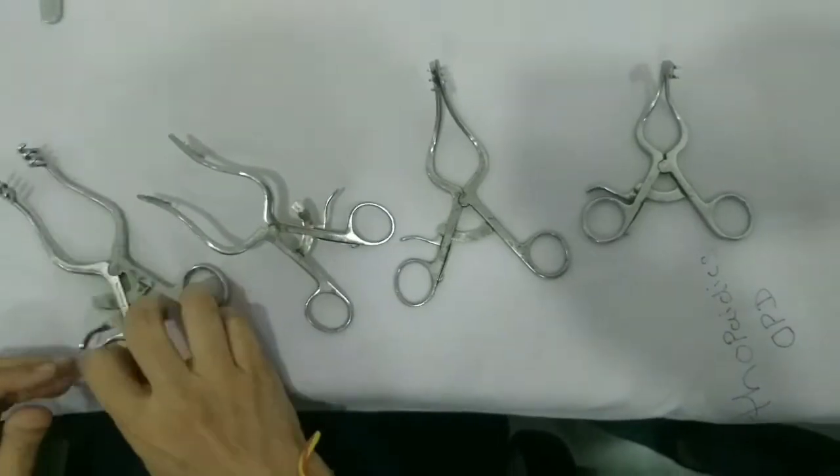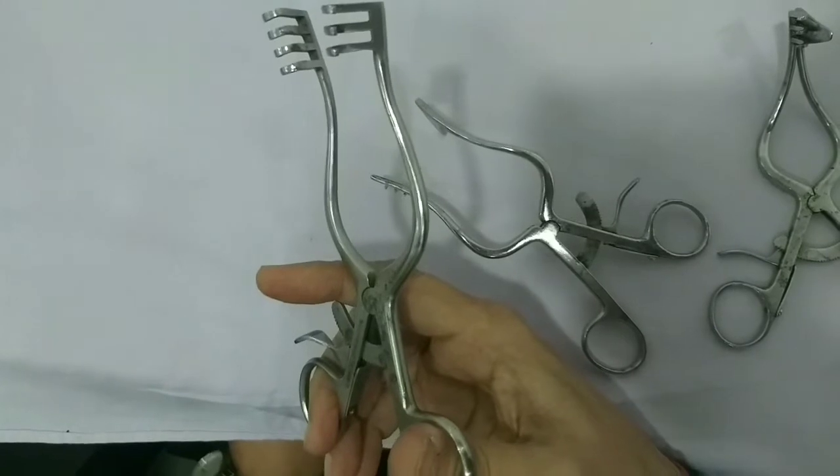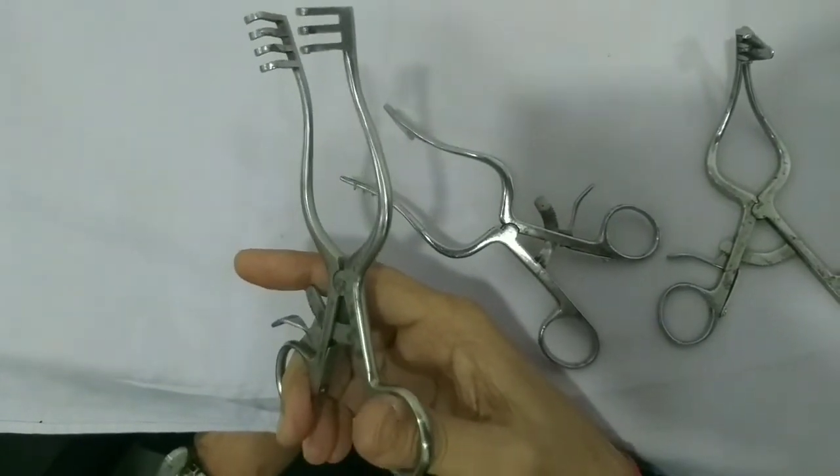This instrument can be used even for neck surgery — for thyroid or for thyroglossal cyst, or for small cervical node excision, we can use this retractor there as well.